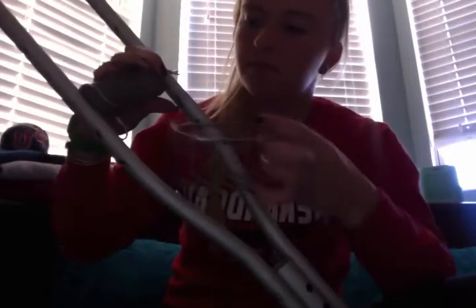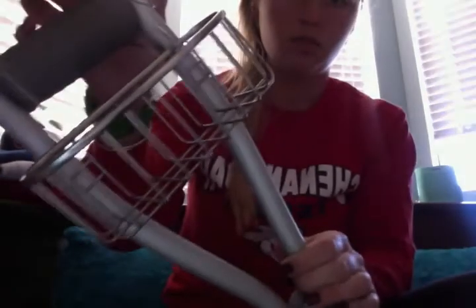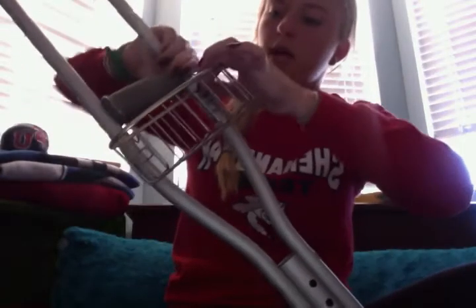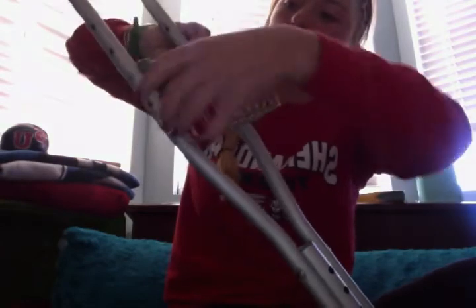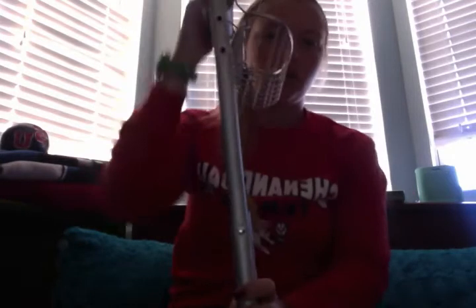From there you simply take your basket and hook it through as well, then clasp the hooks back just like you would with your shower curtains. And it'll stay right there like this.